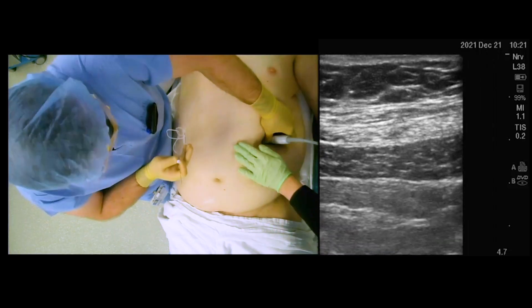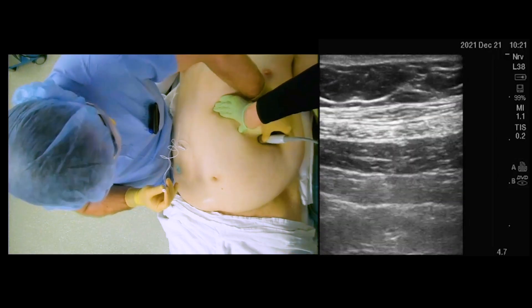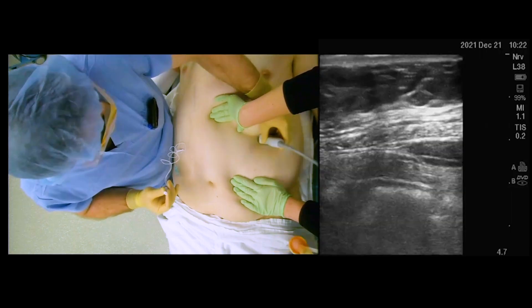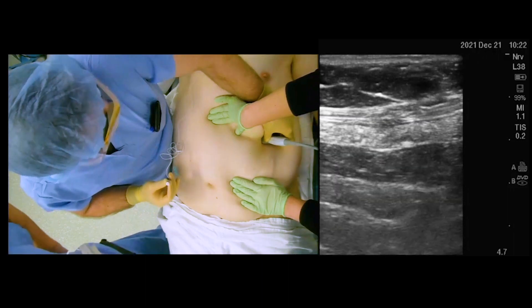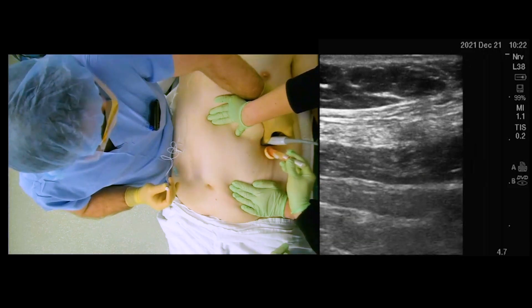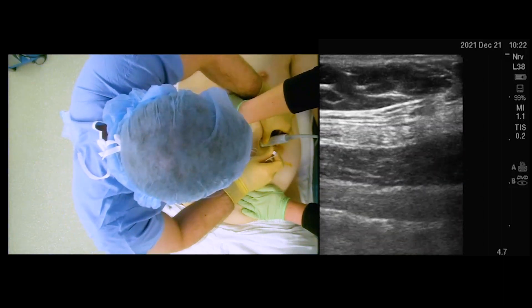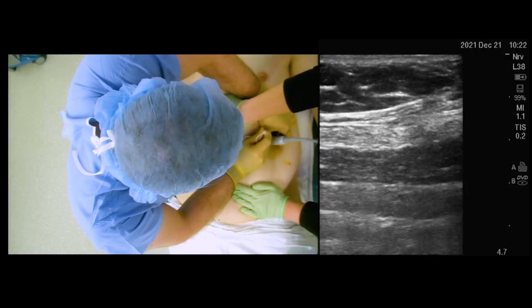Here, the three layers of the abdominal wall are again identified. An assistant was able to provide traction on the skin to facilitate needle placement. Once appropriate visualization was obtained, the skin was prepped with chlorhexidine, and the needle was once again placed with an in-plane approach.